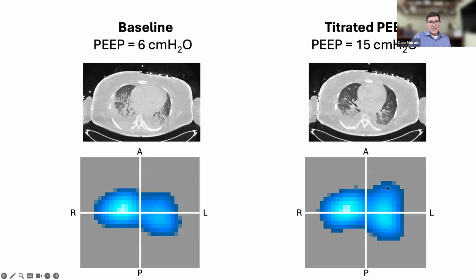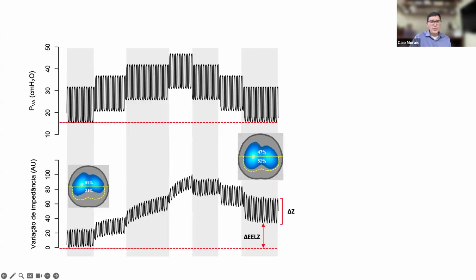So in this case, if I have this image from this patient, I would say that PEEP of 15 in supine position is probably not the best approach, and I must try prone positioning and repeat the procedures to check if prone positioning would improve even more this part that PEEP of 15 was unable to fix. So we can use this image at the bedside to better understand the response to PEEP and better define the next treatment.